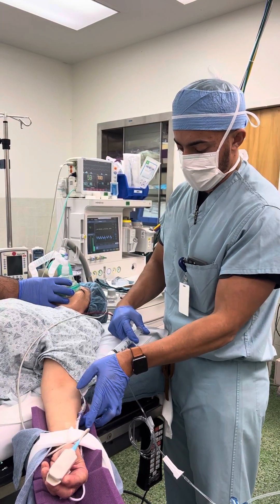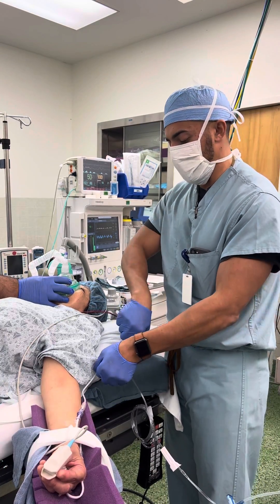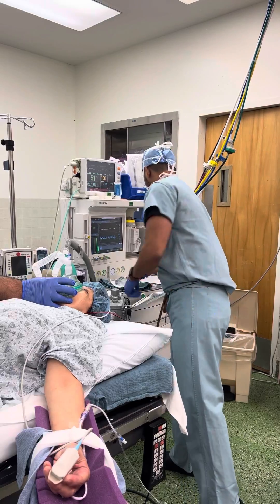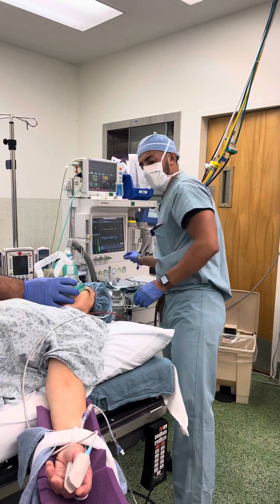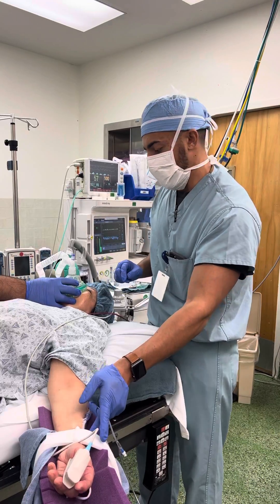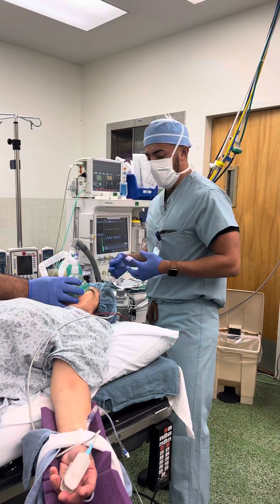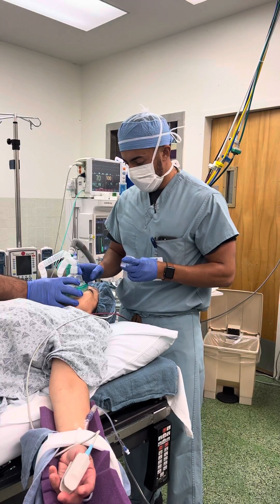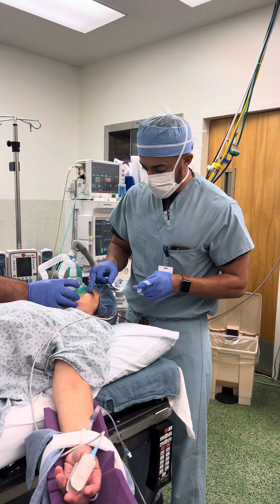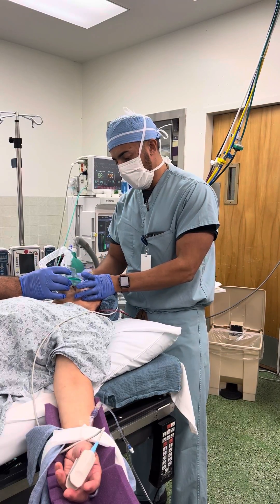Big breath. Good. I'll let that kind of kick in. Lidocaine works a lot with the burning. She'll take her last few breaths here before she goes out. I'll do the eyelid test here — we can wipe that a little bit. I'll cover her here.